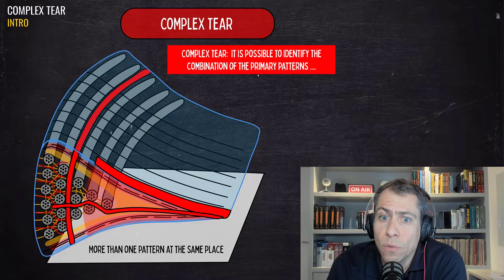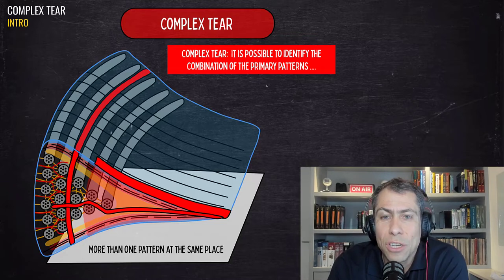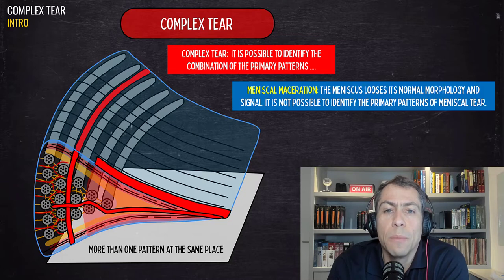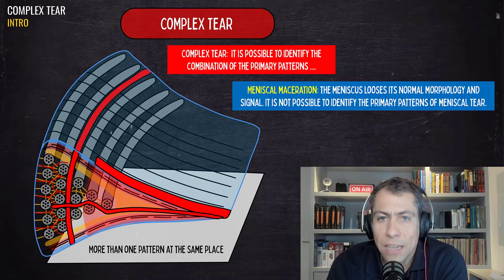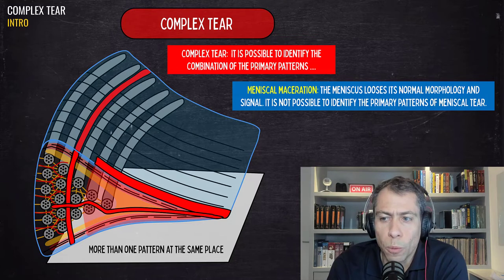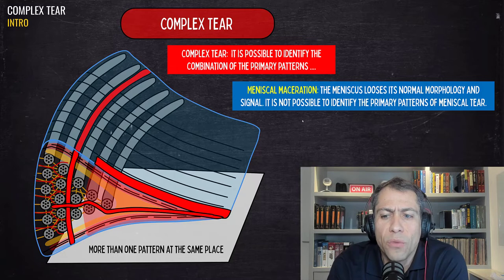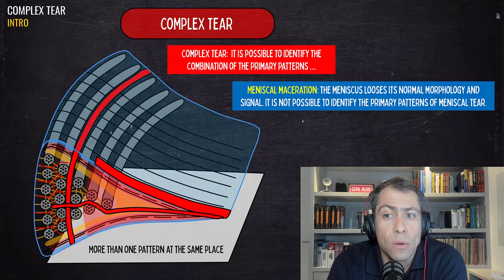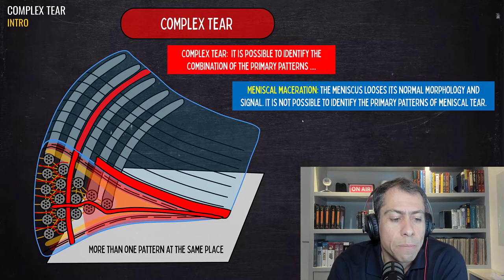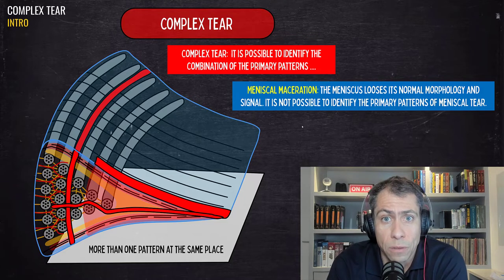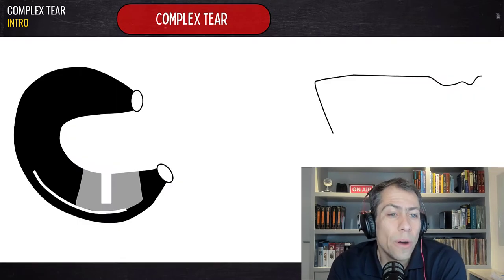That definition is very useful to make a distinction between the complex tear and meniscal maceration. In the case of meniscal maceration, the meniscus loses its normal morphology and signal, and it's not possible to identify the primary patterns of meniscal tear in a specific meniscal region.